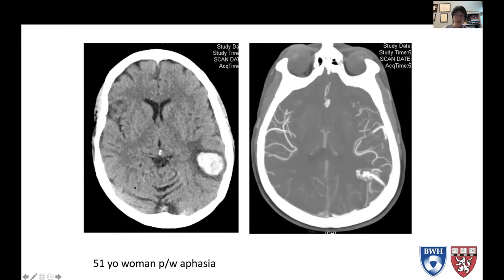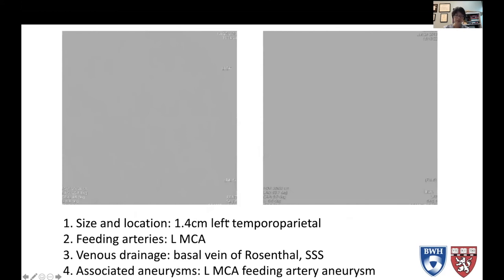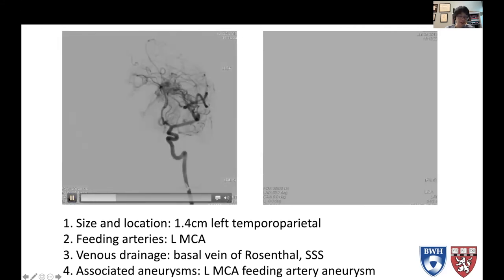This is a 51-year-old woman who presented with aphasia. You can see there's an intraparenchymal hemorrhage in the left temporoparietal lobe. The CTA shows an associated AVM — it looks like a tangle of vessels. So how do we describe this? First, size and location: it's about one and a half centimeters in the left temporal parietal area.